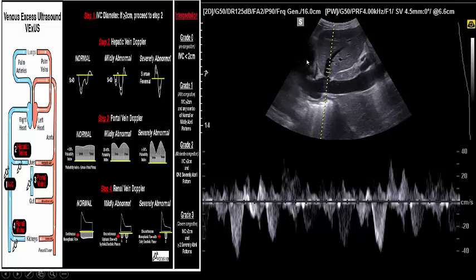But with opening of the tricuspid valve and the gush of blood from the right atrium to the right ventricle, the pressure will decrease again in the right atrium, and you will see too much flow again in the hepatic vein because of too low pressure here, and you will see this another diastolic wave. Very big systolic flow and small diastolic flow, and this is the atrial kick with atrial contraction at the end of diastole.